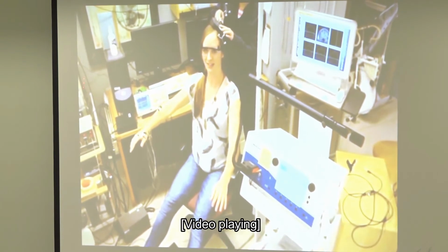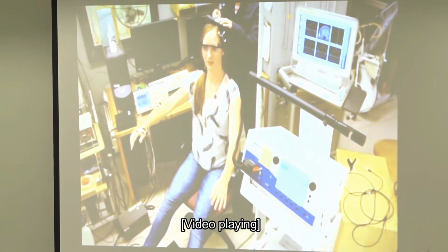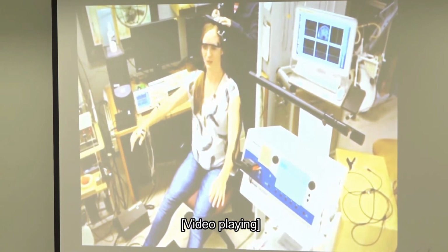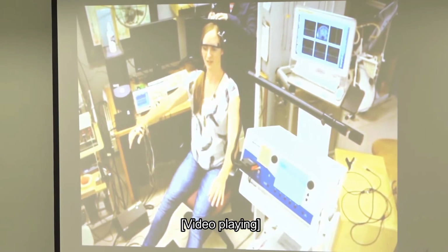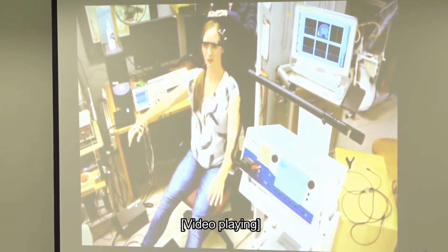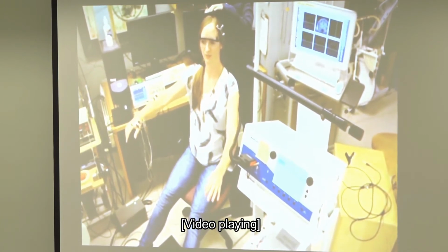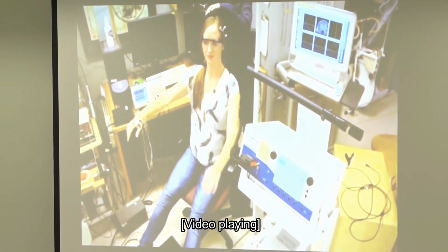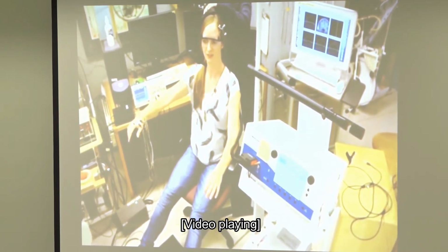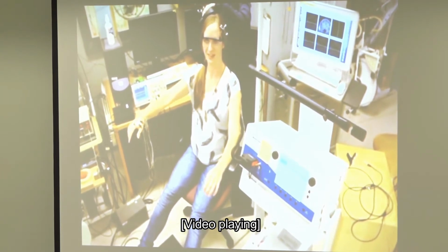So right hand, so hand, and then a little bit of elbow, some now shoulder and leg. You'll still see that right leg, now it comes a little into response here, to my left leg there. We've switched hemispheres, and then now more leg on the left side, left shoulder, left elbow, and left hand.